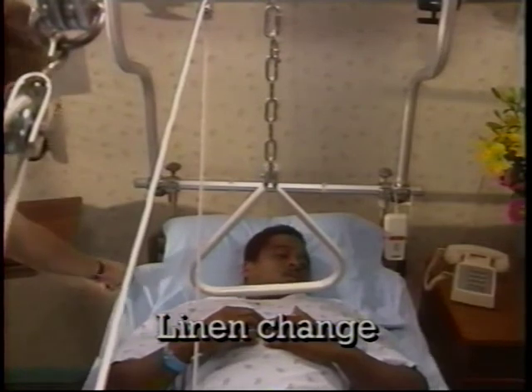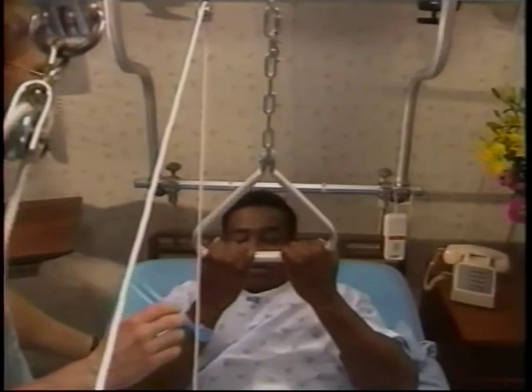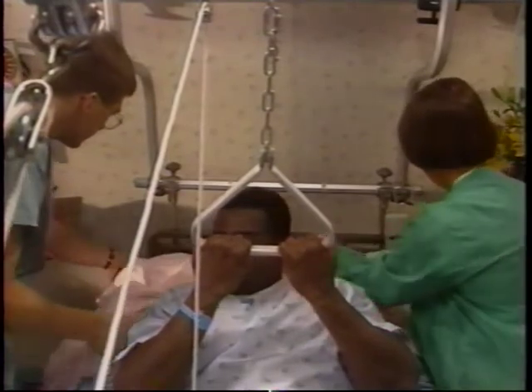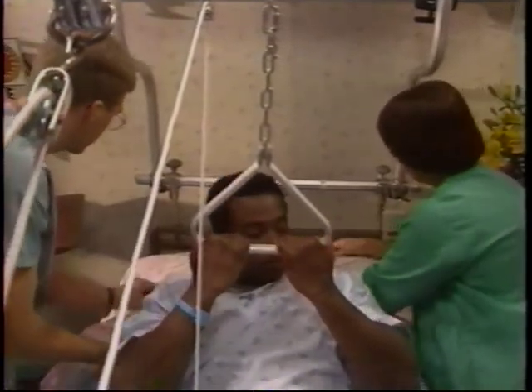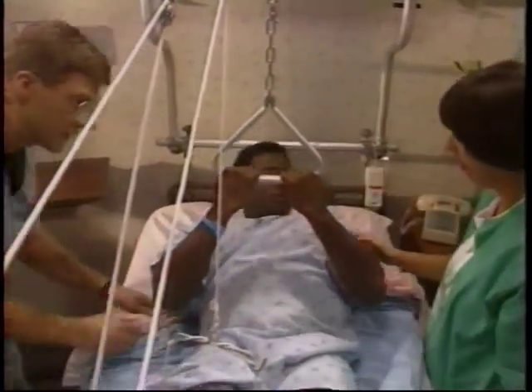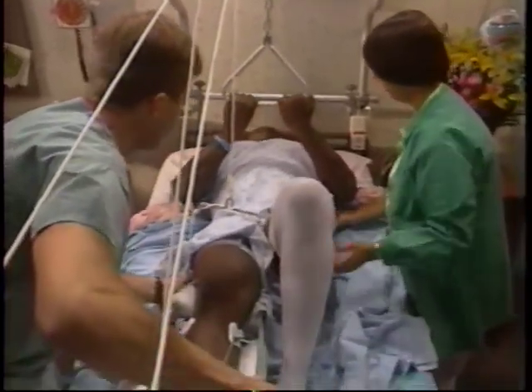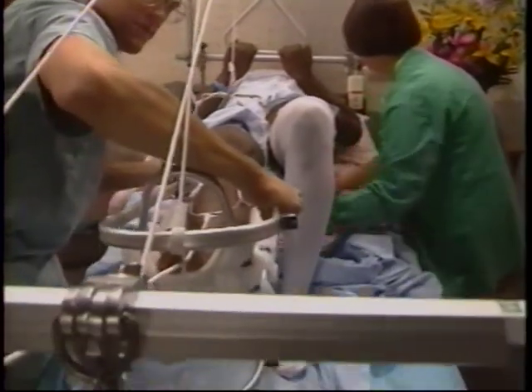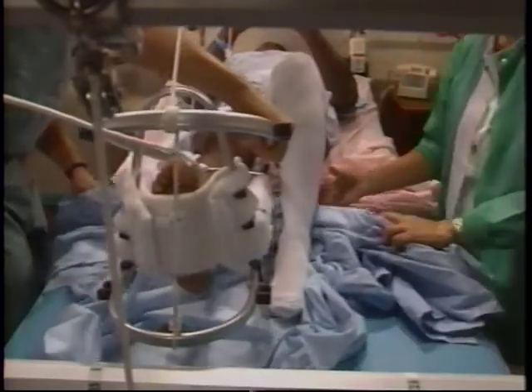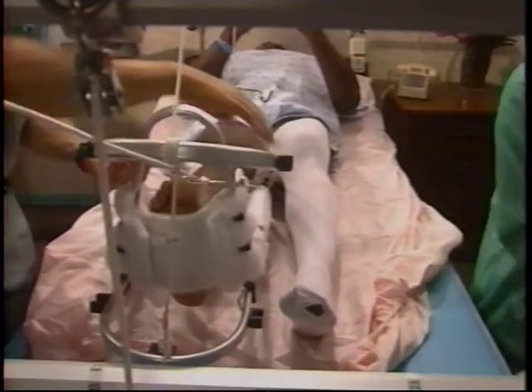Change the bed linens from the top to the bottom of the bed. Remove the pillow and loosen the bottom sheet. Fan fold the clean sheet horizontally and place it under the patient's shoulders. Have the patient raise his shoulders off the bed by using the trapeze. Slide the clean sheet down to the patient's waist while pulling the old sheet at the same time. With an assistant supporting the traction, have the patient lift his buttocks off the bed and continue sliding the sheets to the foot of the bed. Pull the sheet taut to remove all wrinkles and tuck it in.